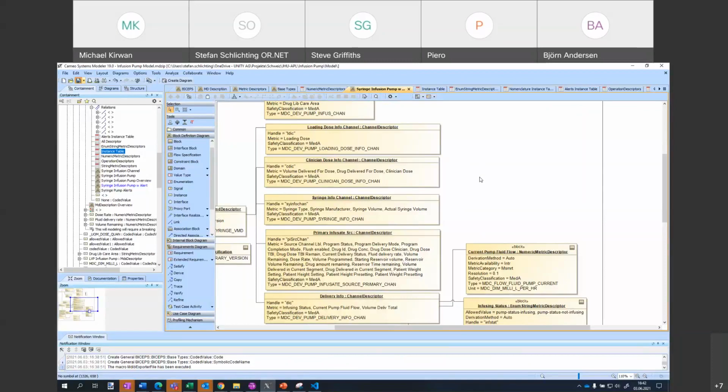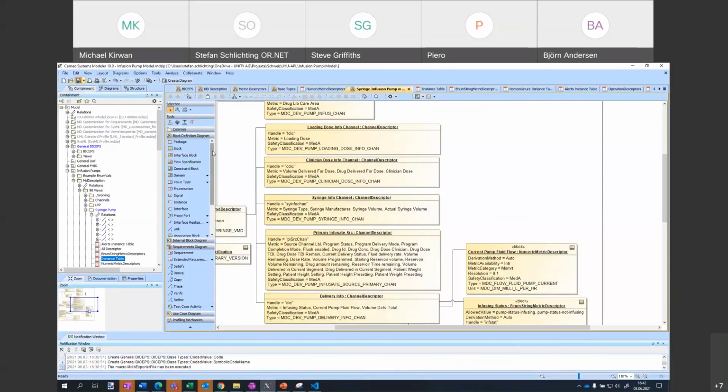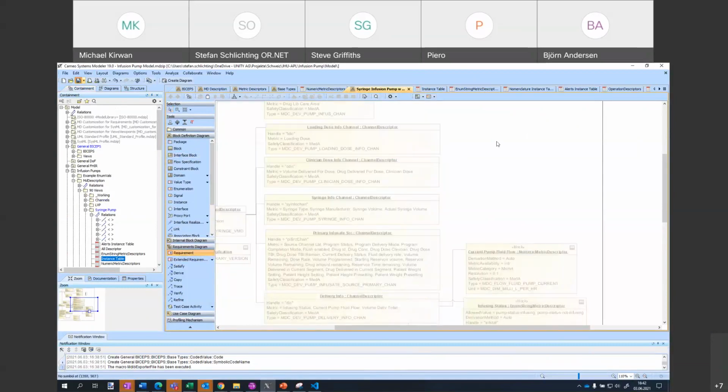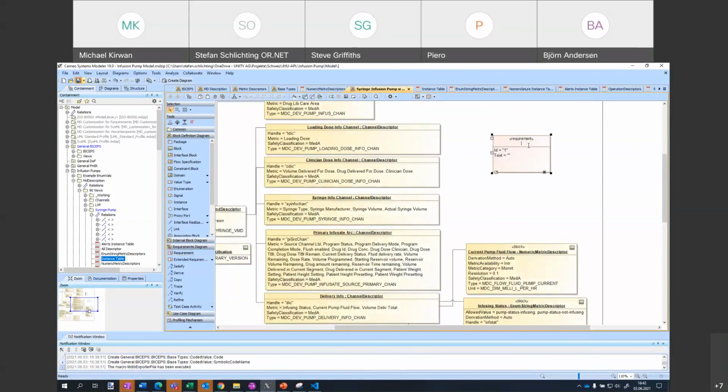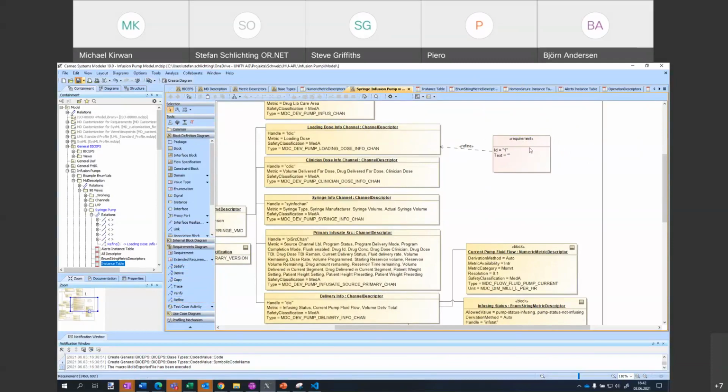I think what's more interesting here is really all the other stuff that you can't do in XML so easily. You can associate it, of course, with requirements. So if you have special requirements, you can add them here. You can import the requirements, and let's say you want to say this is somehow applicable to this one. You could maybe say, okay, this is derived, or that's a refine for this object, and you can link all the requirements to it. I think that's something you couldn't easily do in the XML representation, to have all these links to which objects does this requirement belong, and so forth.